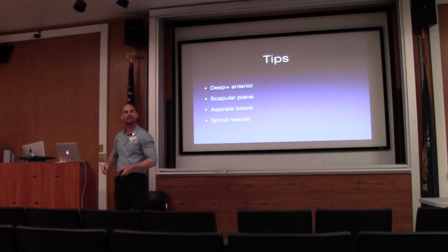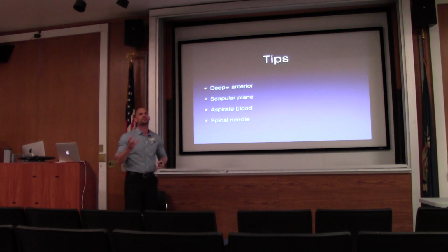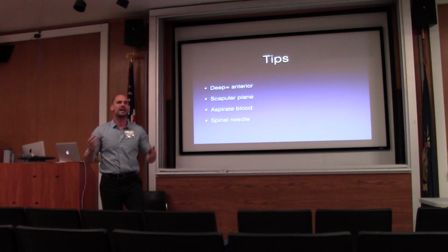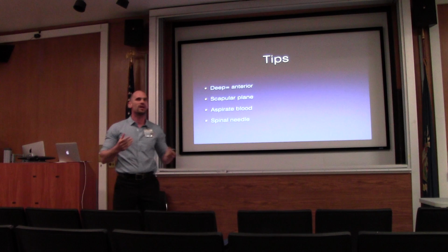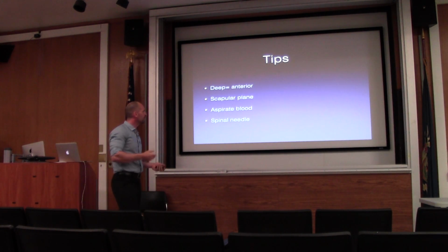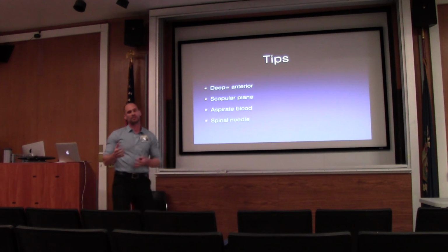I've got nothing else to say about the evidence. I think you guys know it. Just in terms of doing the procedure, I'm not going to go into too much of the technical component, because I think you can pretty much all stick a needle where you need to be. I think the important point is to find the area where you're going, right? And if you've done them with me, again, it's going to be a 3.5-inch spinal.